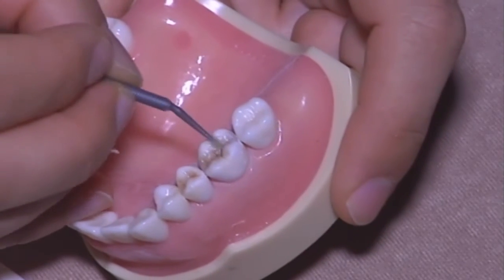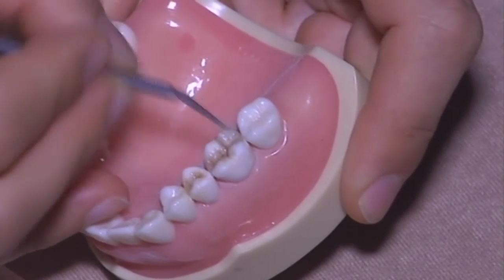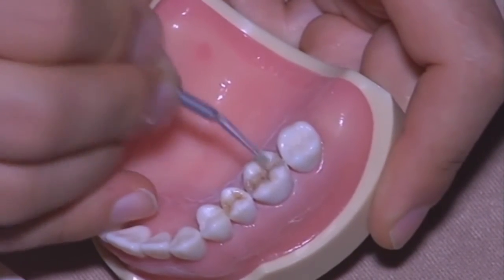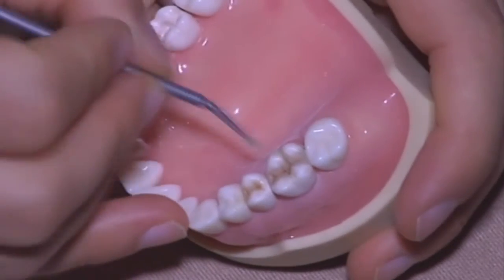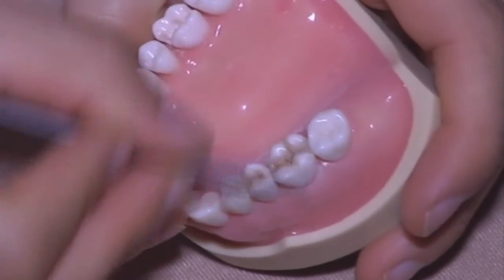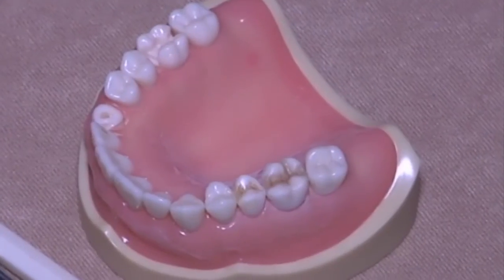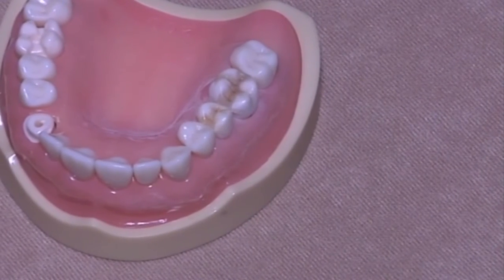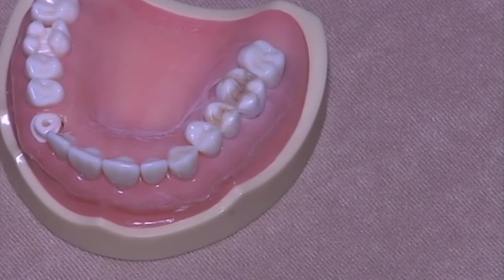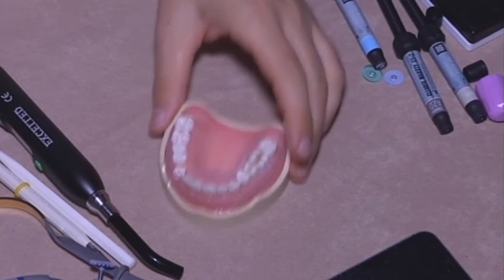Because I spent minutes to create wonderful anatomy, occlusal and sulcus, and it's a pity that they become blue because of the silicone. Brown is natural, blue is not natural at all. Okay, but here we can just pass an adhesive to obtain the same cleaning effect. And then we just have to go with brushes to clean everything up.